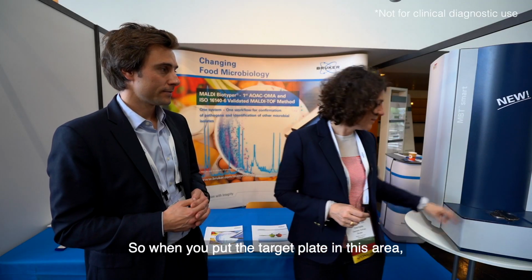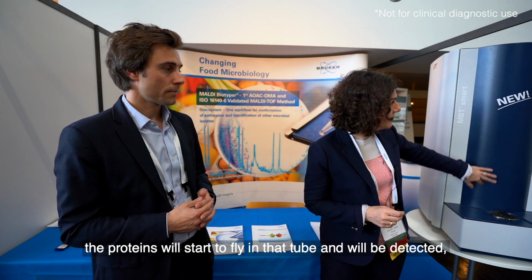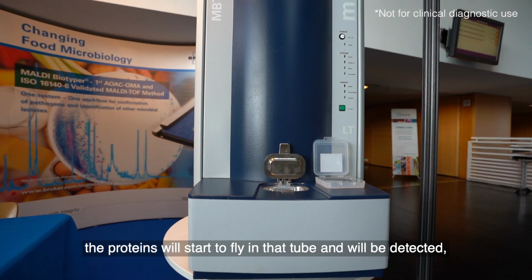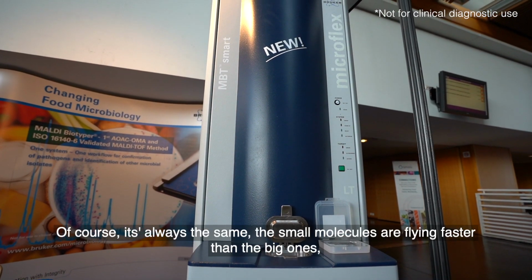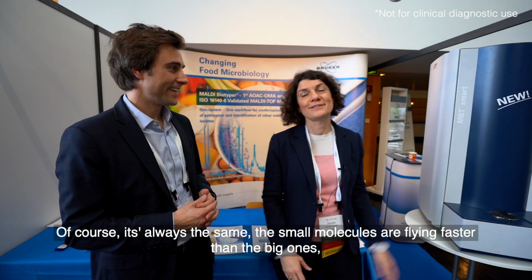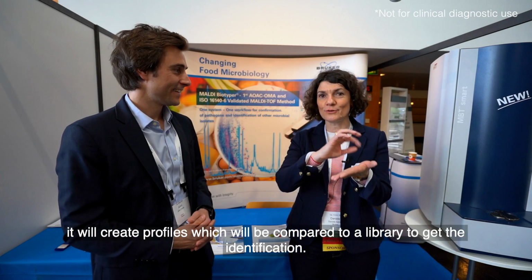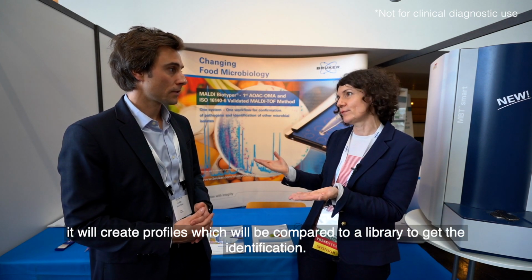So when you put the target plate in this area, in fact, the proteins will start to fly in that tube and will be detected by a detector to get a profile. Of course, it's always the same: the small molecules fly faster than the big ones. And then you create this profile to compare to a library and then to get the identification.